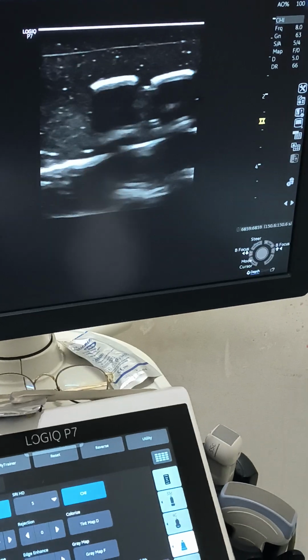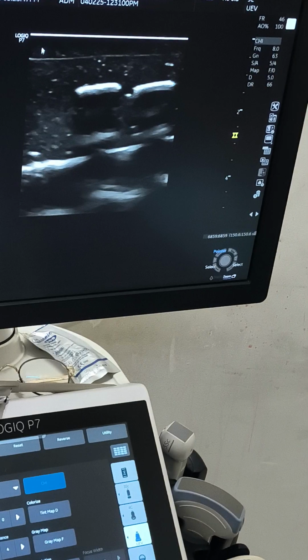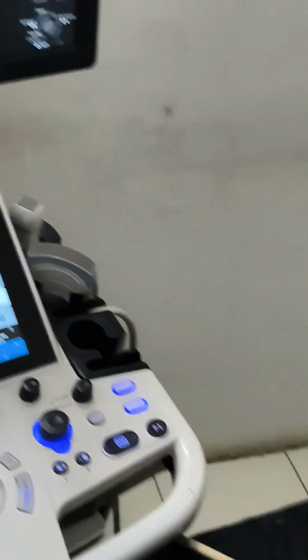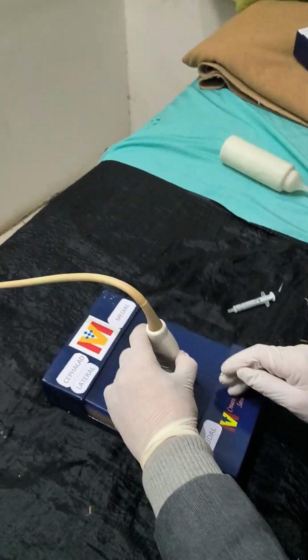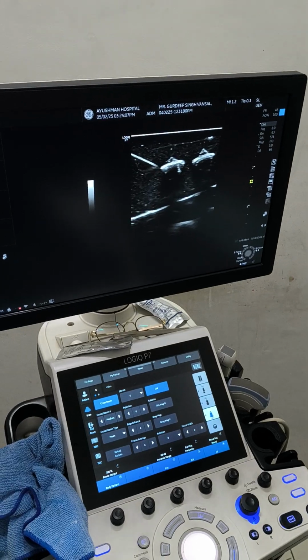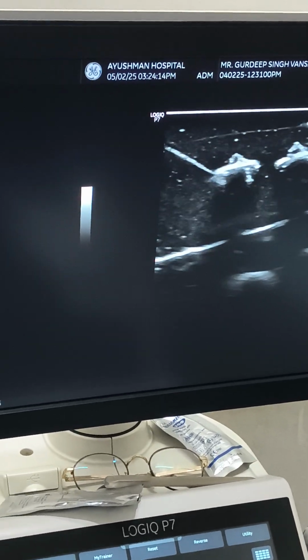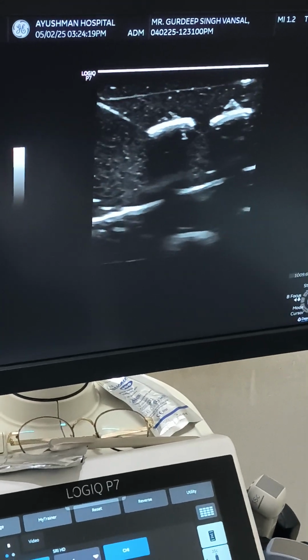So again, if I ask you to calculate the angle, so I have to come here, and this is 90 degree. So for me, it is approximately 45 degree. That's what I am going to do, and let's see where we reach. Okay, now, so that is the needle approaching and hitting. So you can feel the bony structure when you touch the tip of the transverse process, and here you need to lift the fascia of the erector spinae muscle.